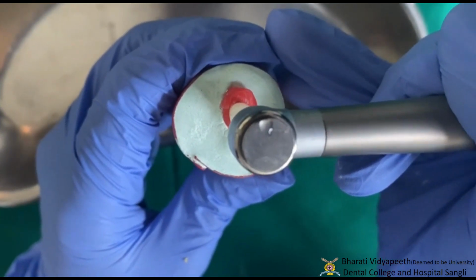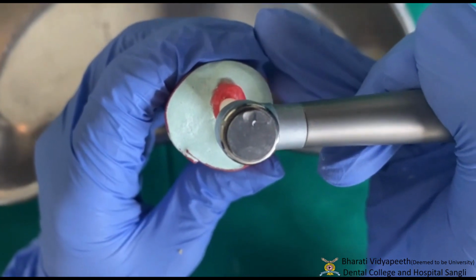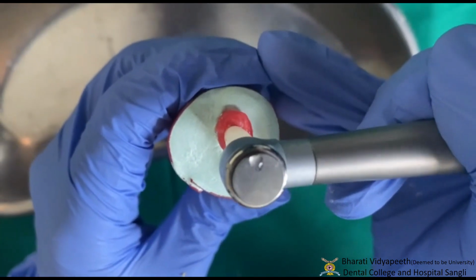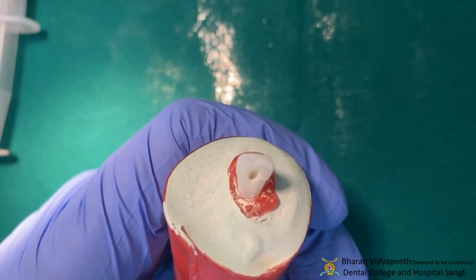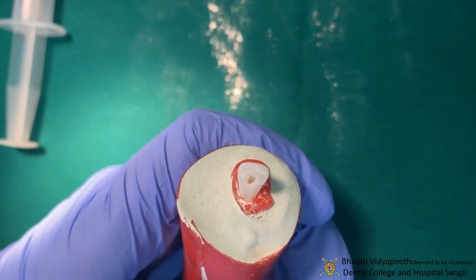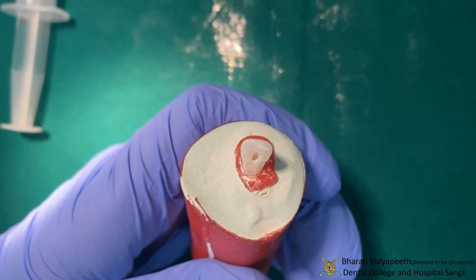The overhanging enamel and dentine of the palatal roof are removed, including the pulp horns, with the help of the round bur. This is done in an inside to outside motion following the internal anatomy of the pulp chamber. The shape of the access cavity for the maxillary lateral incisor is triangular, with the base of the triangle incisally and the apex cervically. After completing the access opening, we'll shift to the biomechanical preparation.